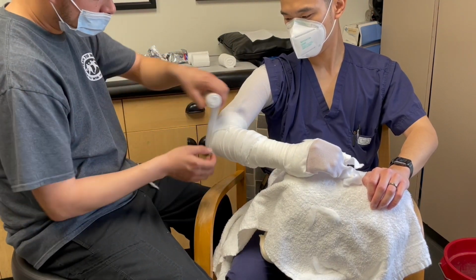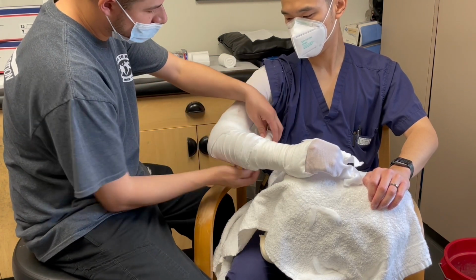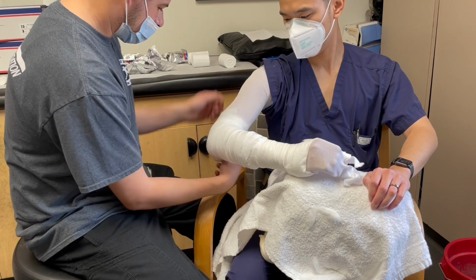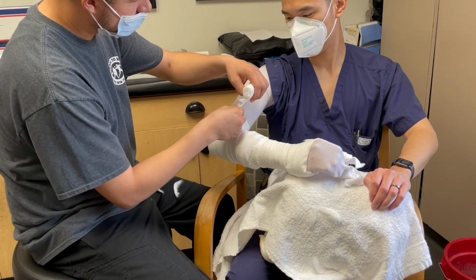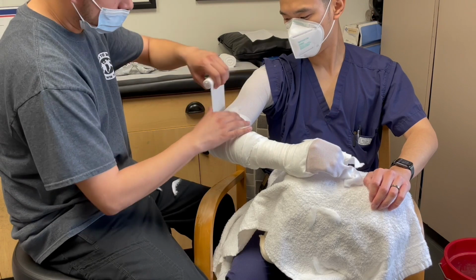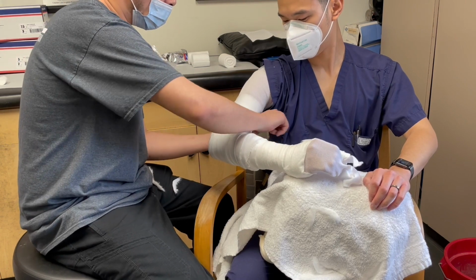If the padding is wrapping around proximal to the elbow joint, we should make a tear at the bottom of the padding. Now if the padding is wrapping around below the elbow joint, we should make a tear at the top of the padding. As we apply the padding at the humerus, you can see here that we do a 50% overlap over the previous layer.